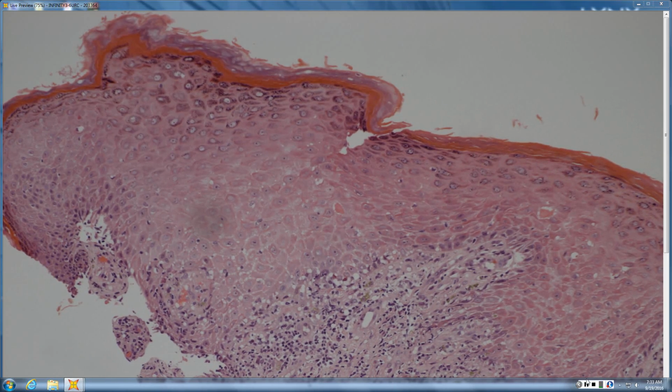Yeah, good point. So, lichenoid drug, if you have EOs and parakeratosis, it's a good hint that it's not lichen planus, but you have definite cases of lichenoid drug that don't have EOs in your biopsy specimen. So, good to consider the whole lichenoid differential when we have cases. Well done.